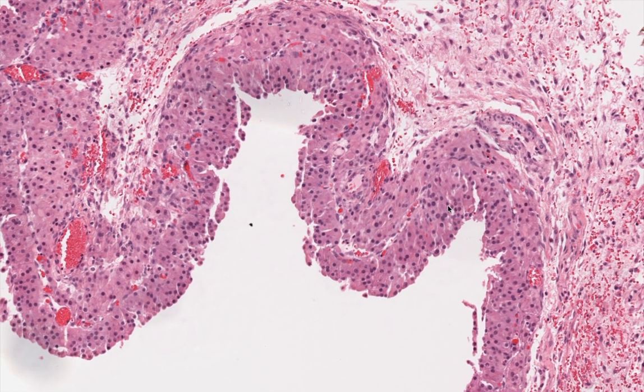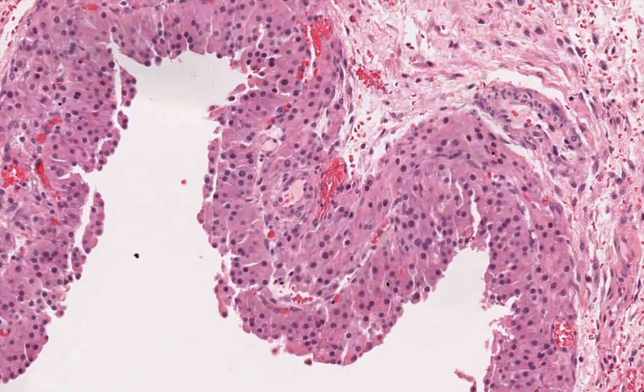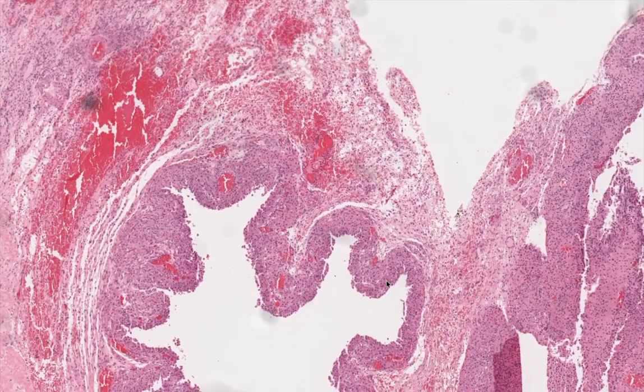Sometimes you just get biopsies of ovaries with corpus lutea, and you look really closely and these cells can look quite alarming because they've got big nucleoli in them. But no, it's okay. These are just corpus luteum cells.